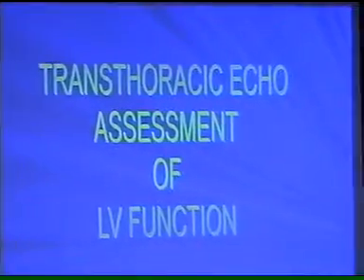But now coming on to the topic, transthoracic, the topic of the day is assessment of ventricular function, especially in relation to ischemic heart disease. When you get a report, again my emphasis is on prescribing, getting feedback, and then interpreting your results. So when you get a report, look for the systolic and diastolic functions, and look for global and regional function. Systolic function, global and regional. Diastolic dysfunction, global and regional. So go through all these parameters.